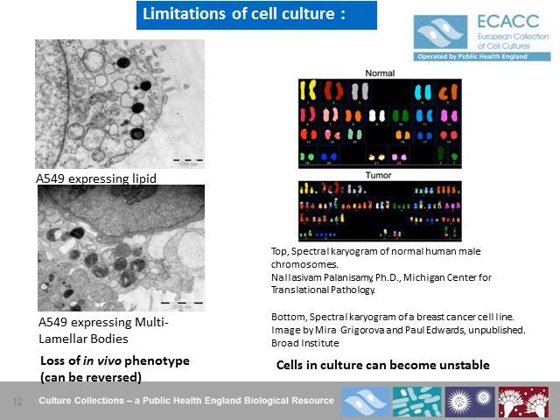The majority of conventional continuous human cell lines have been derived from cancers and are subject to genetic instability due to their aneuploid chromosomal makeup. It's demonstrated here on the right in these 2 karyograms, the top showing the normal human karyotype and the lower from a breast tumour displaying abnormal chromosome numbers and translocations. This can cause variability in the cultures from one culture to the next and will be made worse through continual subculture, highlighting the need for controlled cell banks.